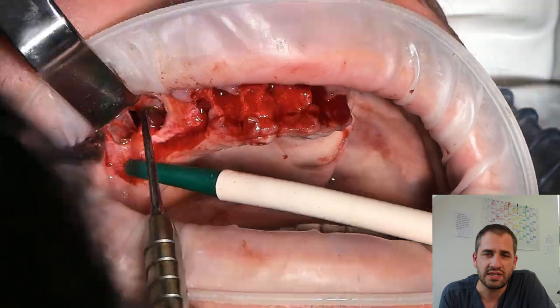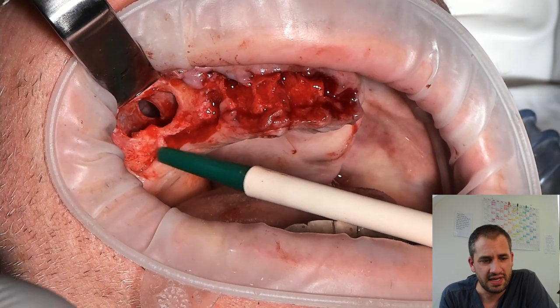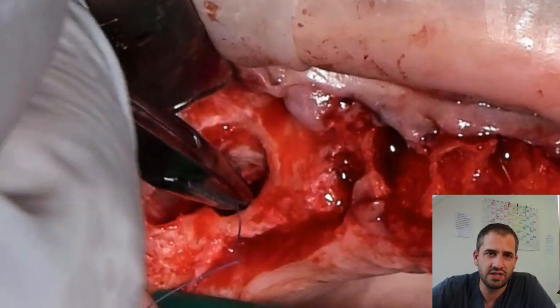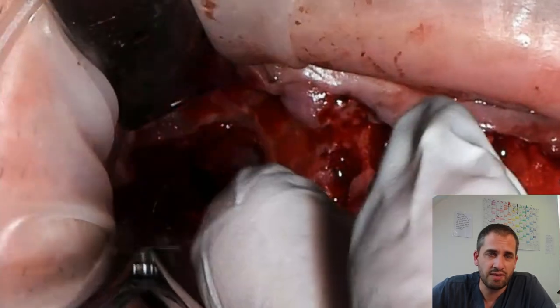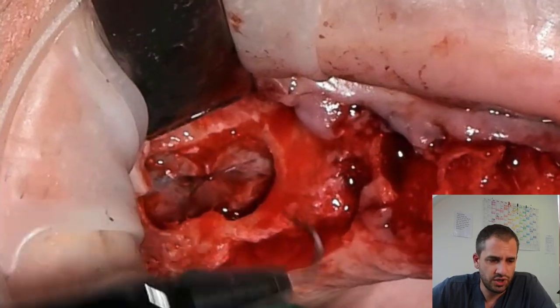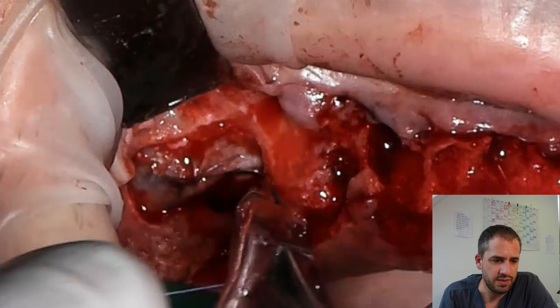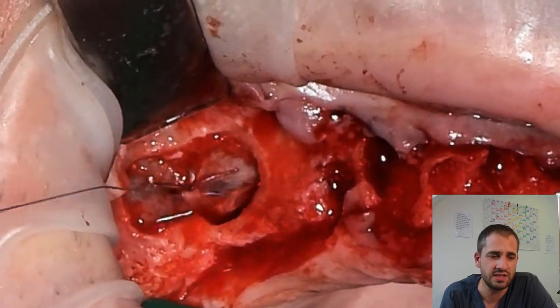Here you can see that I got a rupture of the Schneiderian membrane. When I have something like that, I make the fenestration to the sinus a little bit bigger. When it's possible, I try to suture the rupture with resorbable sutures. It takes some time to do that. That's the second suture and you can see there's a second dehiscence and I have to make a third suture. But then we can go on with the plan.